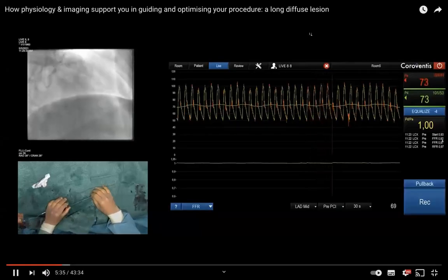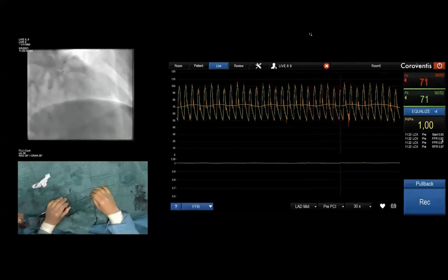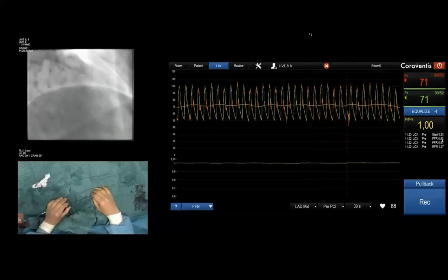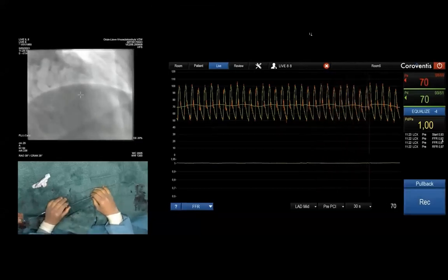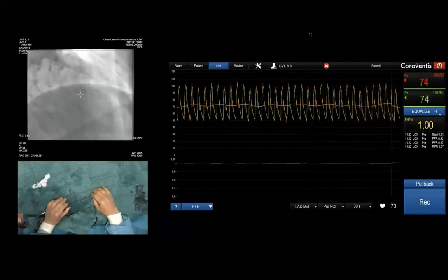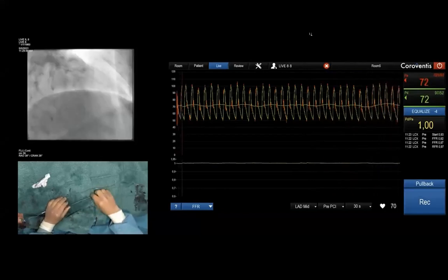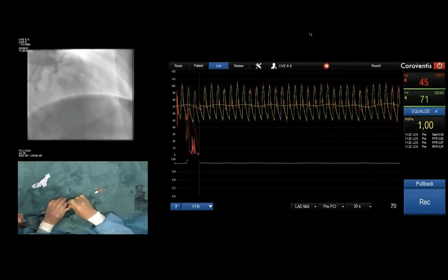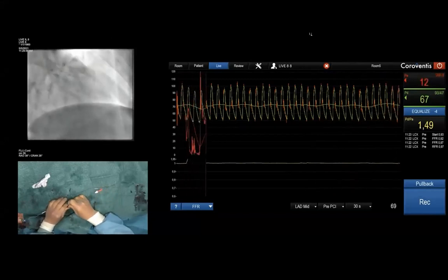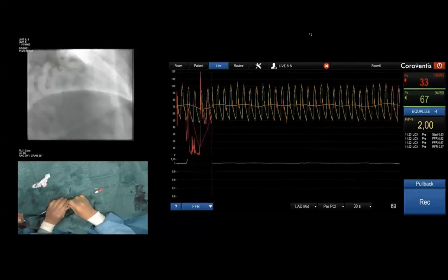We are ready for the equalization. We can perform the equalization again. I will insert again the needle in the hemostatic valve here.